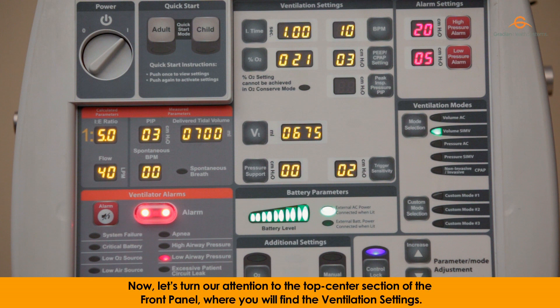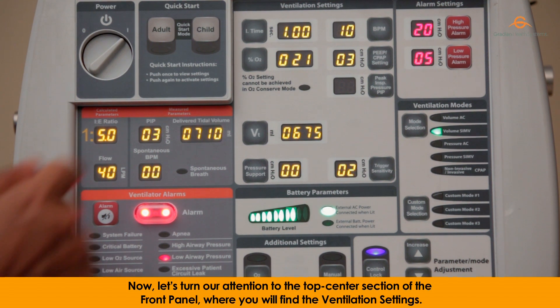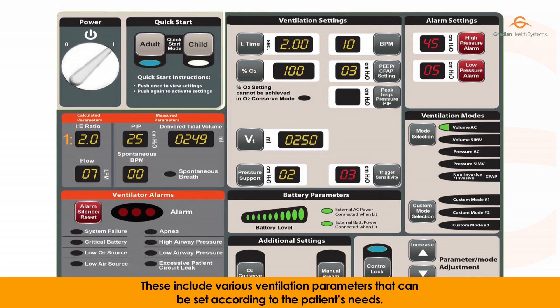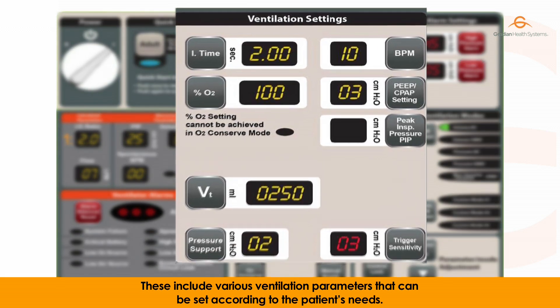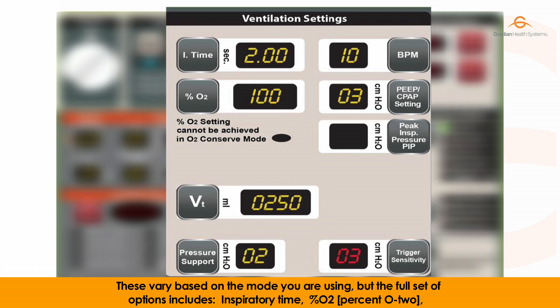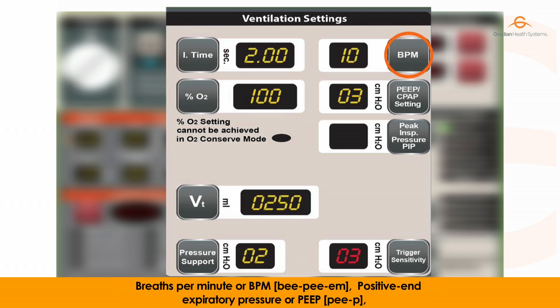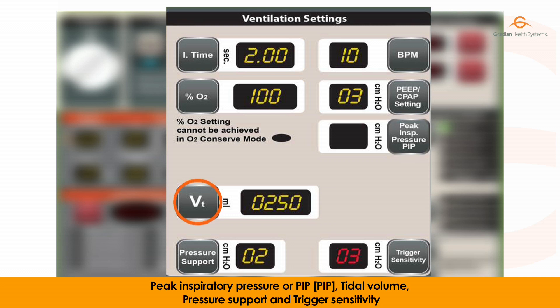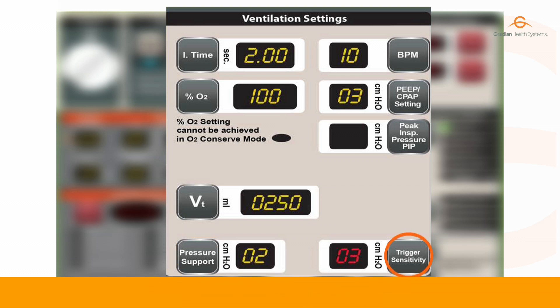Now let's turn our attention to the top center section of the front panel, where you will find the ventilation settings. These include various ventilation parameters that can be set according to the patient's needs. These vary based on the mode you are using, but the full set of options includes inspiratory time, percent O2, breaths per minute (BPM), positive end expiratory pressure (PEEP), peak inspiratory pressure (PIP), tidal volume, pressure support, and trigger sensitivity.